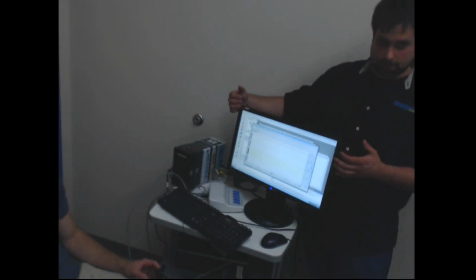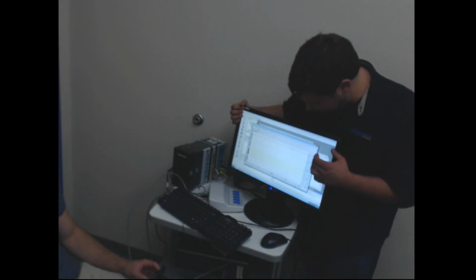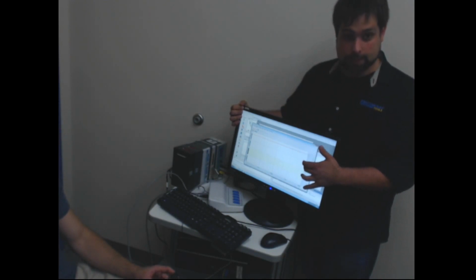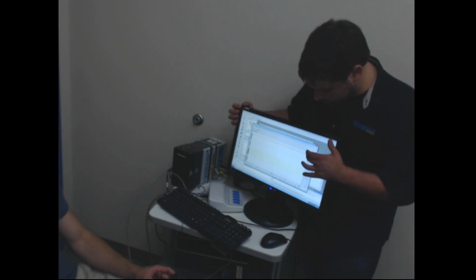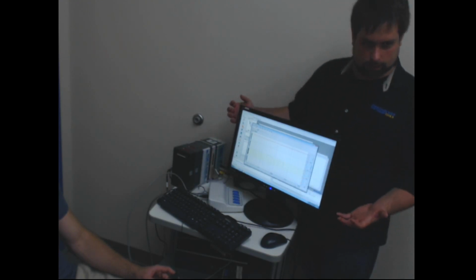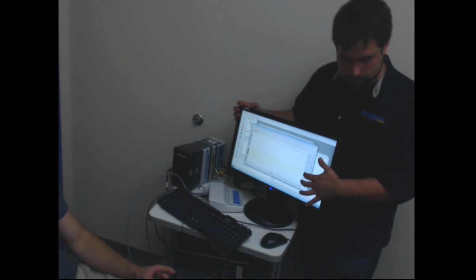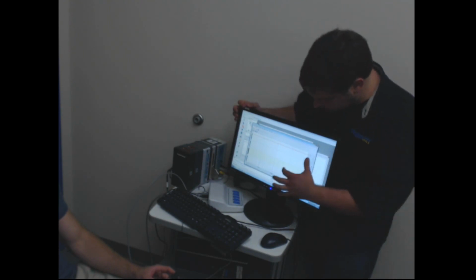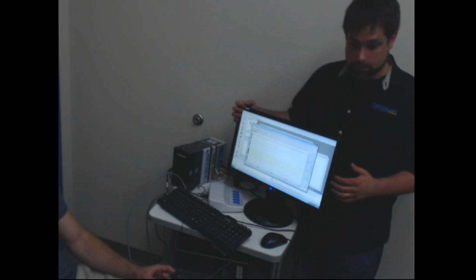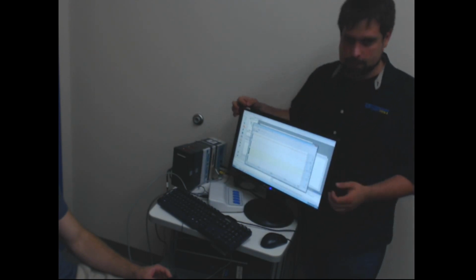There we go. So if you can see the way that Biopac sets everything up here, the top two leads here are my respiratory belt, and this is the GSR. But the more relevant ones to the webinar are going to be these bottom two. The bottom two are actually going to be my digital in 1 and my digital in 2. So this is 14 and this is 15 in our signals.